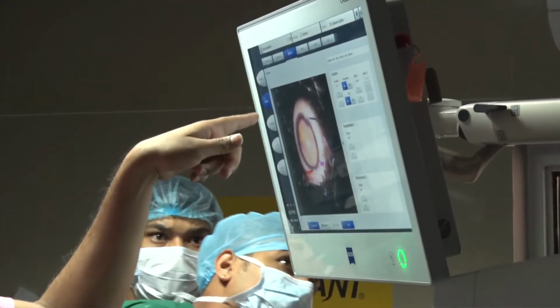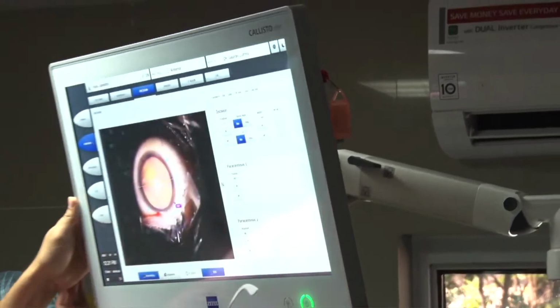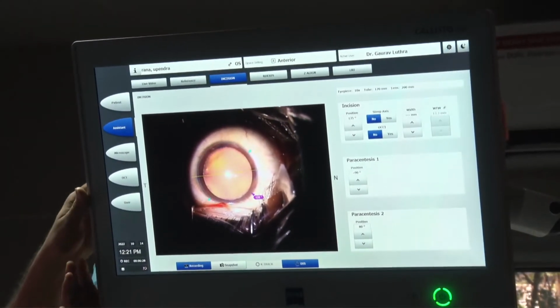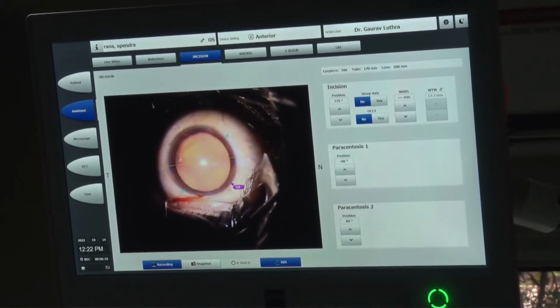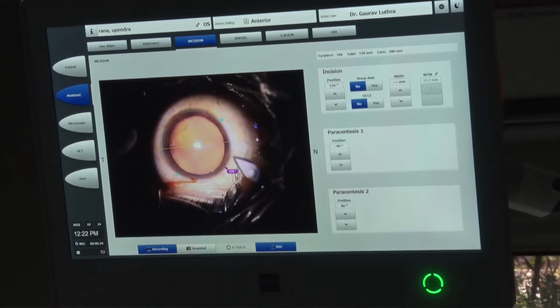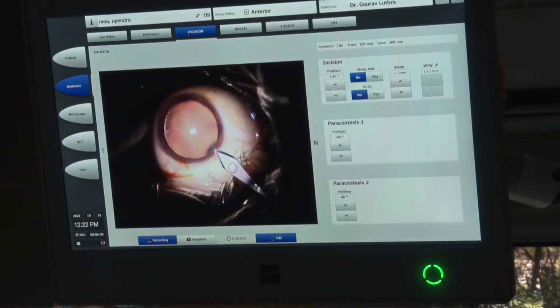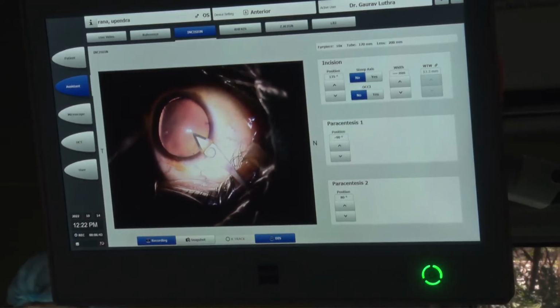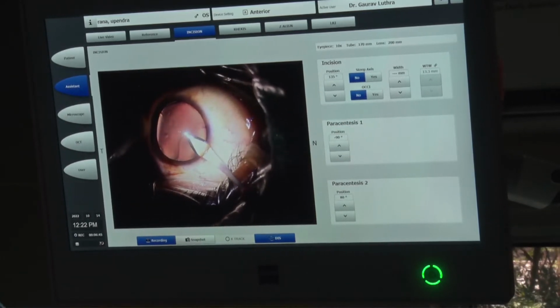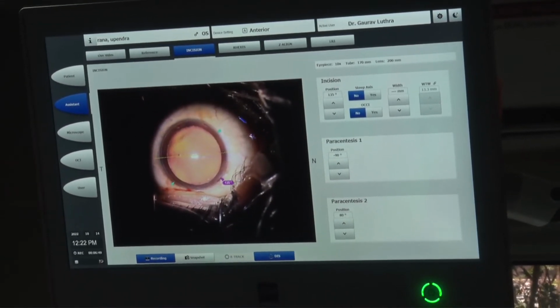Now it is visible. Yes. Right. We are trying to show it from the screen directly. Yeah, better. Nice. But is the depth of focus perceptible there or not?